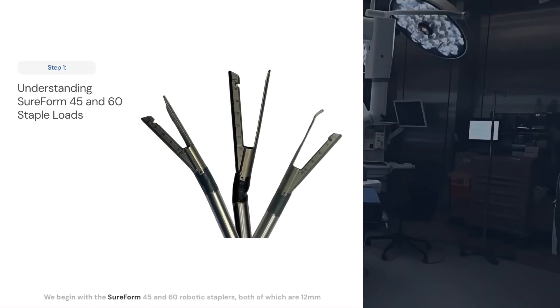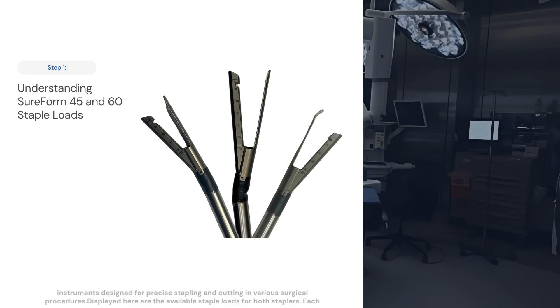We begin with the SureForm 45 and 60 robotic staplers, both of which are 12mm instruments designed for precise stapling and cutting in various surgical procedures.